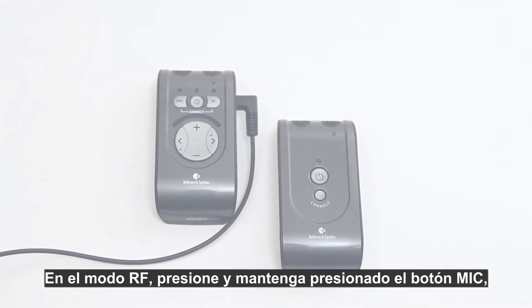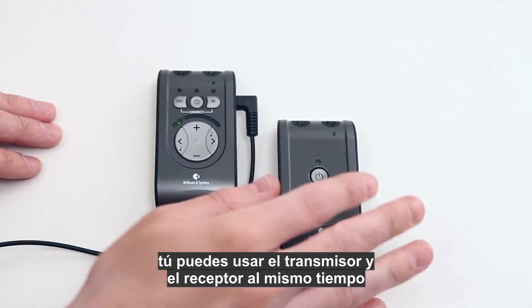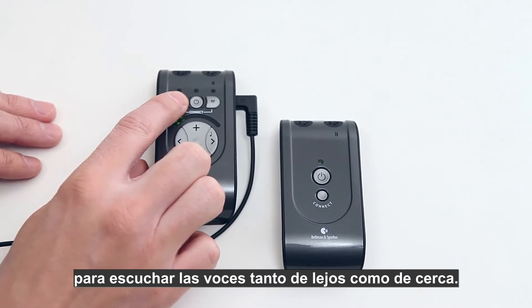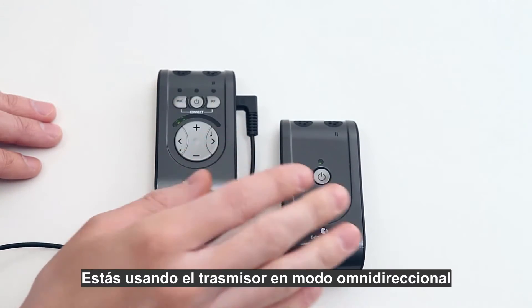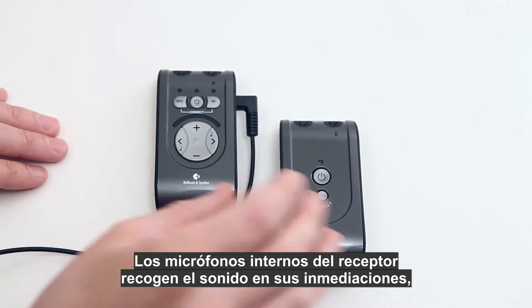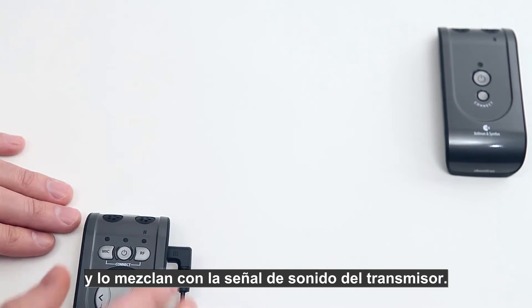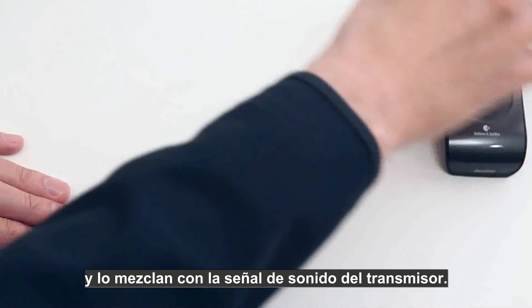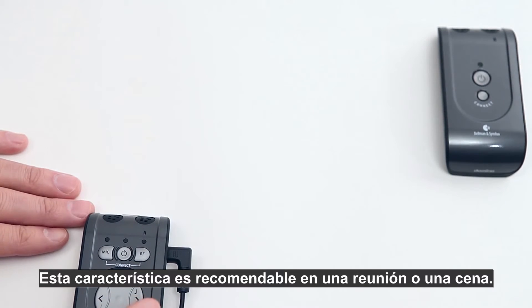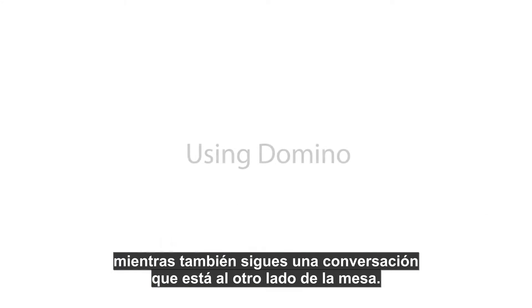By pressing and holding the mic button, you can use the transmitter and the receiver at the same time to listen to both distant and nearby speech. You can use the transmitter's omnidirectional mode to pick up sound at a distance, while the receiver's internal microphones pick up sound in your vicinity and mix it with the signal from the transmitter. This feature is useful in a meeting or at dinner when you want to hear people near you while also following a conversation on the other side of the table.